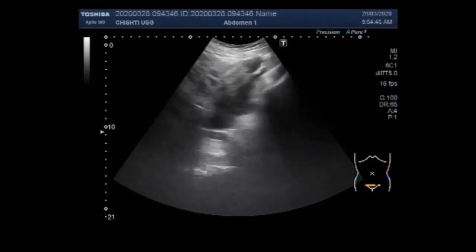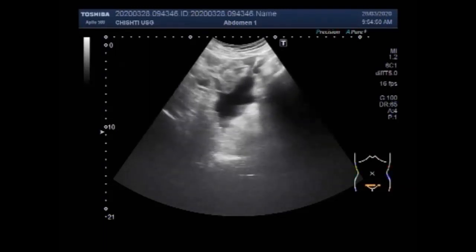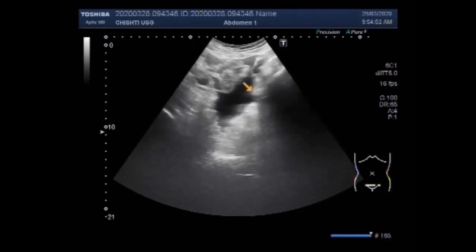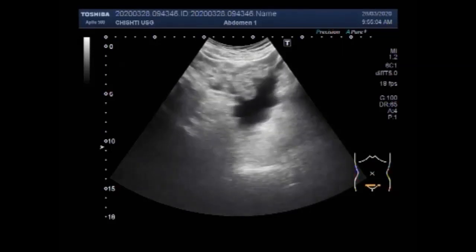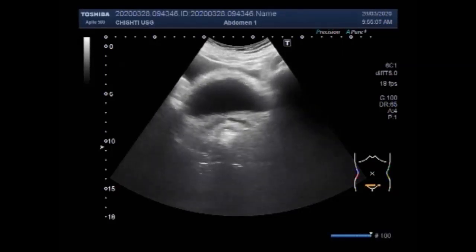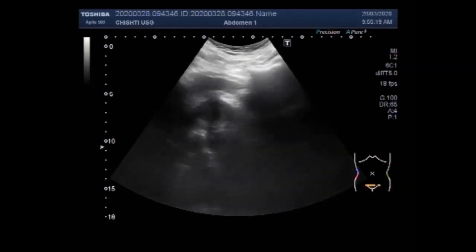Now you can see the pelvic area. A significant amount of free fluid is seen in the lower abdominal cavity. These are the gut loops. The enlarged spleen and the presence of ascitic fluid are suggestive of malignancy.